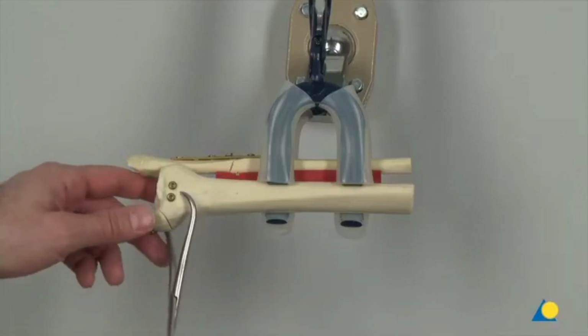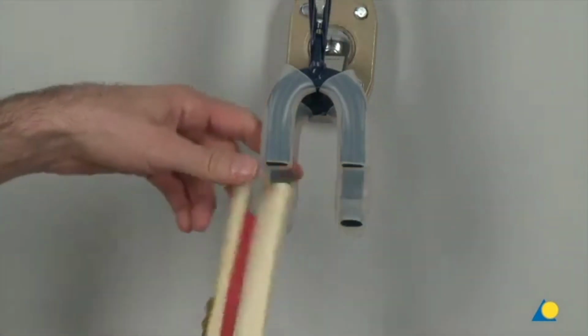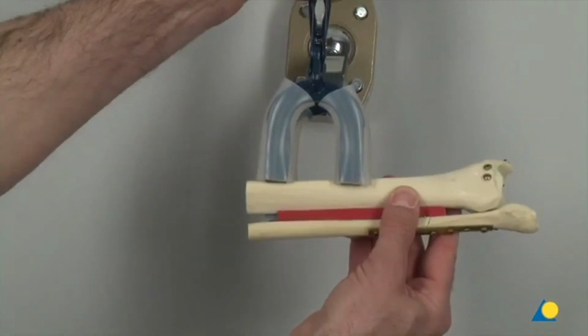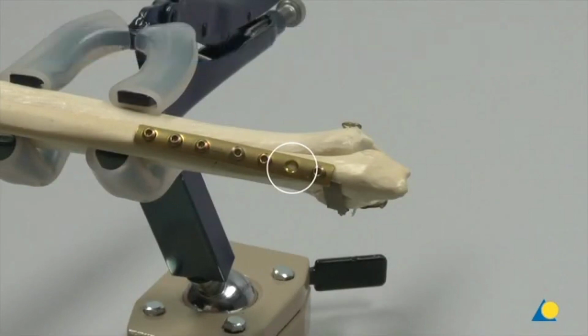The reduction forceps is removed. To facilitate the insertion of the position screw, the bone model is released from the clamp and rotated 180 degrees. To facilitate the insertion of the position screw, the bone model has been returned to its original position. In the clinical situation, the ankle is dorsiflexed for the insertion of the positioning screw. This ensures that the upper ankle joint is at its widest position.